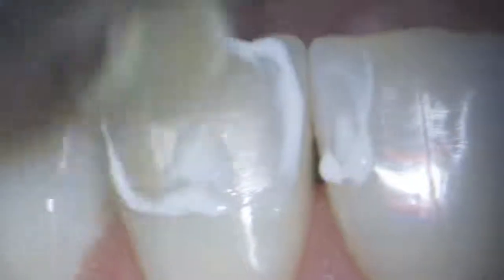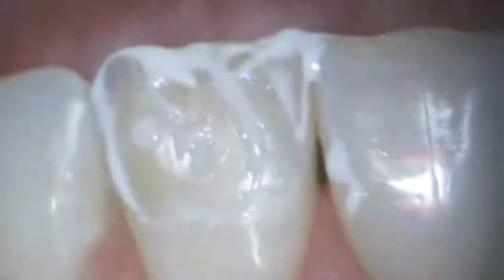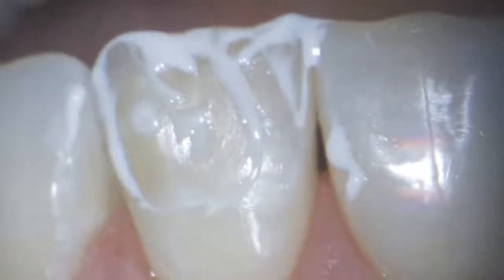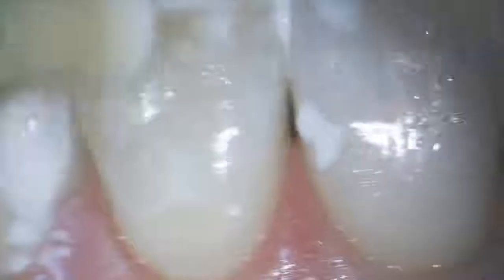The last tool at the stage of polishing in my finishing protocol is polishing paste Prisma Gloss Extra Fine from Dentsply Sirona company on a special sponge and metal holder. You can find this holder and sponge also in the Enhance Starter Kit. For the first few seconds, I use this paste without water cooling, and then I start to add a small amount of water on my contra-angle handpiece.